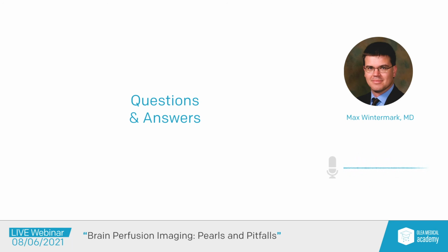What we also sometimes do is, if you don't use those techniques, you can just use two boluses of contrast, and you do a first acquisition at a certain level and then a second acquisition at a higher level. But of course, if you have a volumetric CT scanner and you can do a 4D perfusion CT/CTA, you don't need to resort to those alternative techniques.